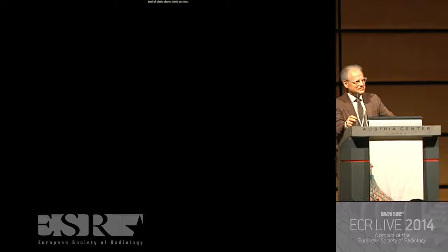So what about DWI, MRI, and other imaging modalities in the patient monitoring? What's the advantage of each modality, and how do you choose? Because we all know that CT perfusion has a lot of radiation. Yes, this is a correct question. I agree with you. Of course, we are trying this technique in a number of cases. We will see the results, and after that we will decide if it is proposable for clinical purposes.